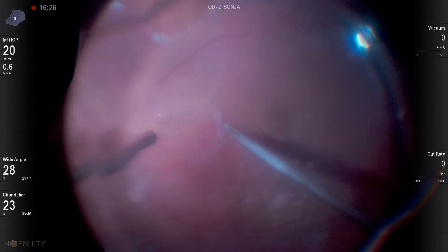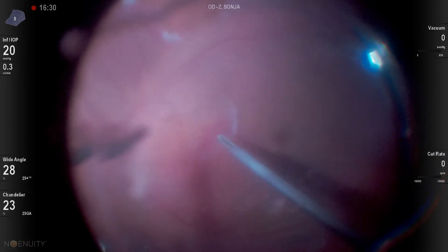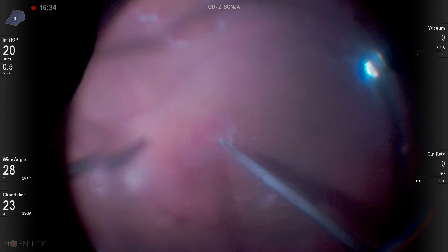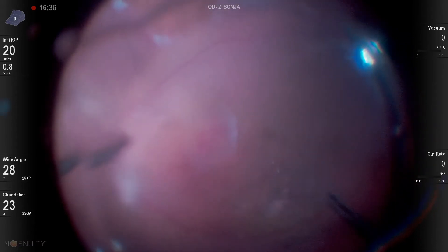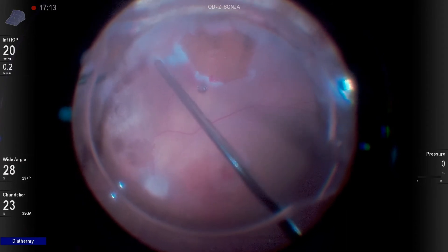I'll go back and adjust it just a little more with closed forceps. I worried about grabbing it because I didn't want it to get stuck on the forceps and then pull it up into the oil and out of the eye. I'm able to maneuver it just right over the macula and it stays there through the entire case.